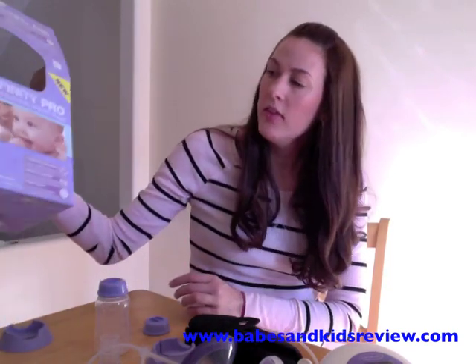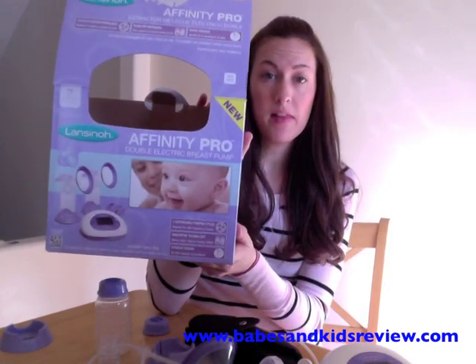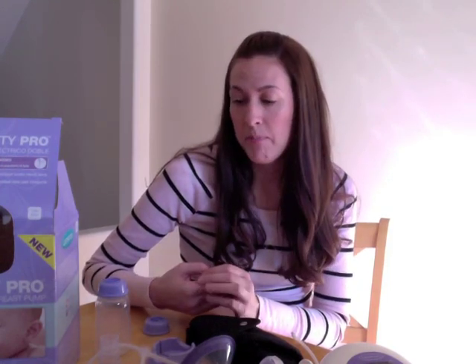Hi, this is Tiff with Babes and Kids Review, and this is the Lansinoh Affinity Pro Double Electric Breast Pump. It's a breast pump that just came out by Lansinoh, and I've actually never used the Lansinoh pump. I am pregnant with my third child, and I did pump with my other two. After my first child I went back to work just one night a week, so I had to pump. With my second child, I wasn't working at the time, but I wanted to be able to have him take a bottle in case of an emergency, or in case my husband and I just wanted to go out. So I did pump with both of them, and I have used Lansinoh products in the past — the breast cream, breast pads, milk storage bags, and cleansing wipes. So I really like Lansinoh products.